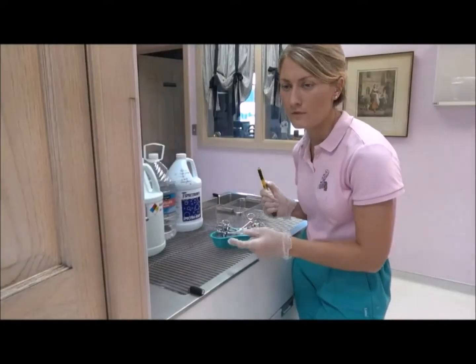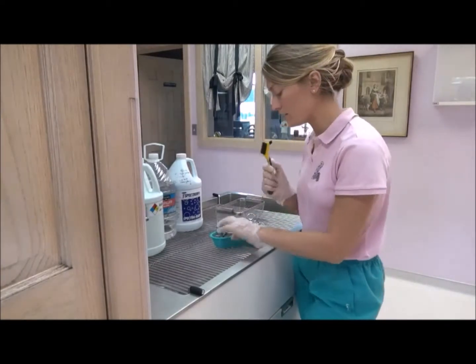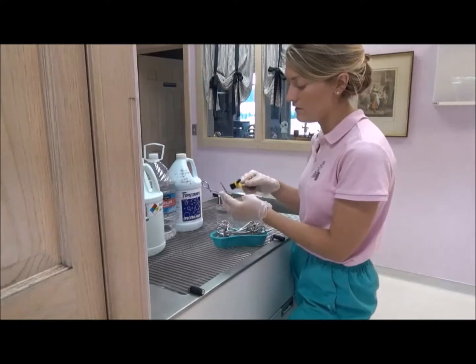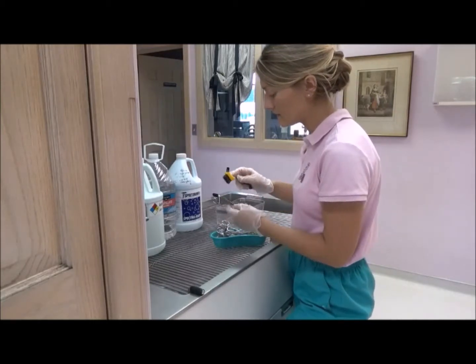To finish properly cleaning the surgical instruments, I'm going to scrub them with the soft bristle brush. And I always wear gloves. For each tool, you want to make sure that you get in all the cracks and crevices and the joints and box locks.